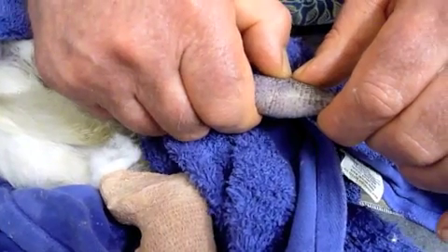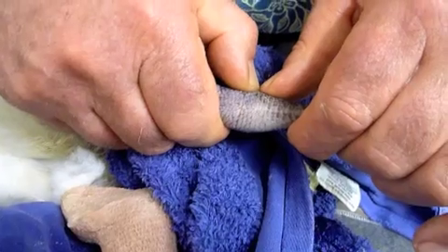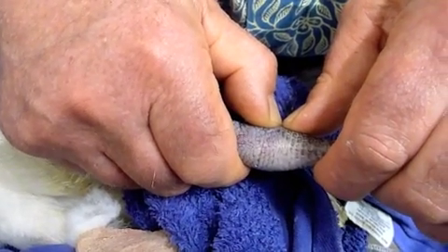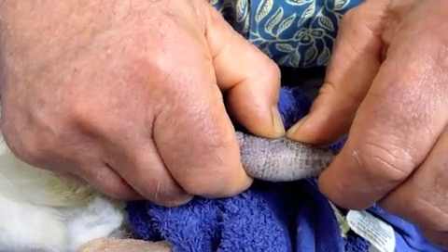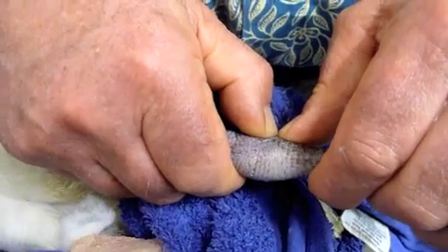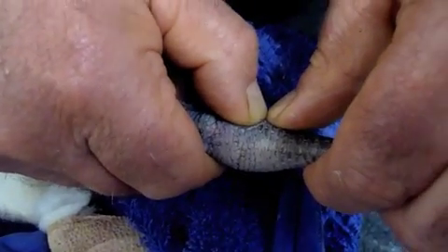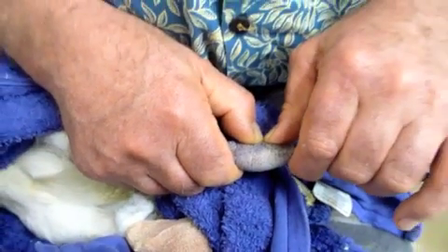Very slowly. I'm imagining microscopically fiber after fiber breaking — not the whole thing cracking open, but microscopically fibers of the callus breaking, stretching, and realigning.